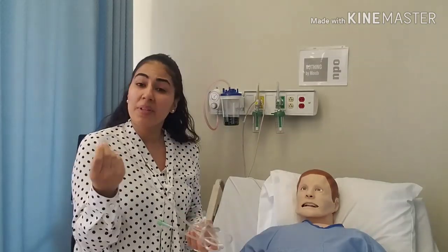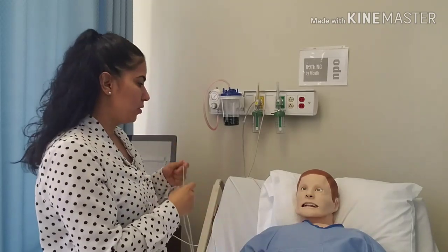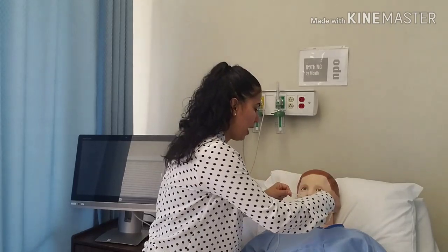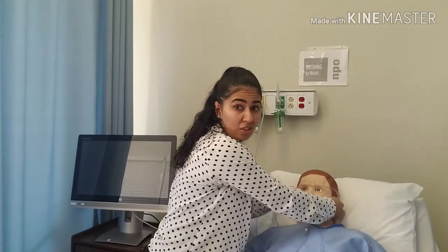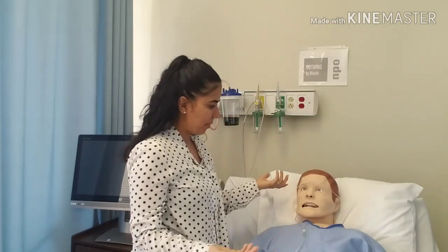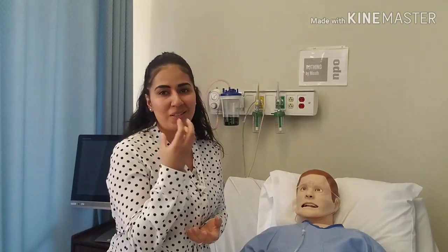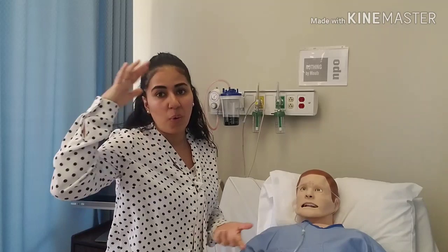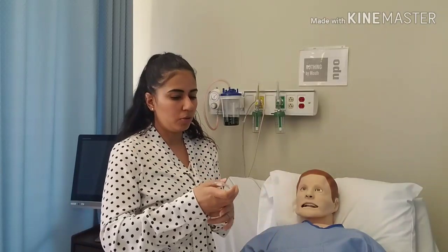I put the prongs in the nares first, then go around the ears, and use the little white adjuster clip to fit it to the patient — not too tight, but secure so it doesn't come off. Some disadvantages of the nasal cannula: many patients forget they have it on and take it off, so you'll walk in the room and find it on their forehead instead of in their nose — often because it's irritating and dries out their nose.